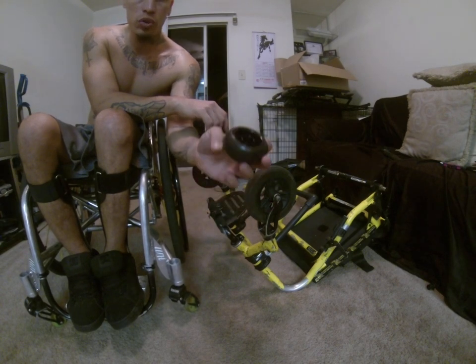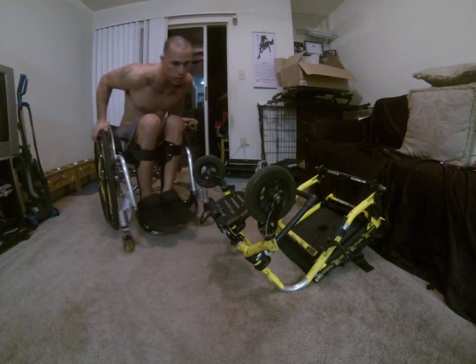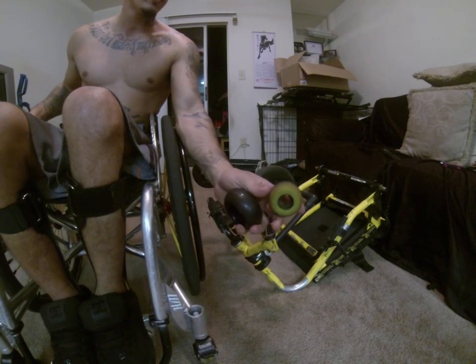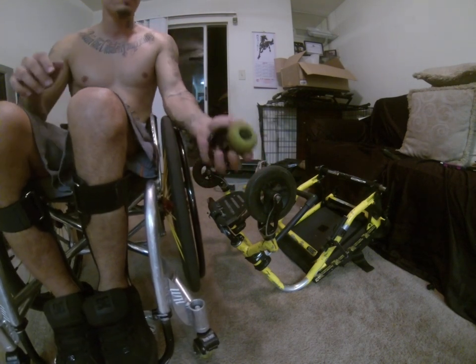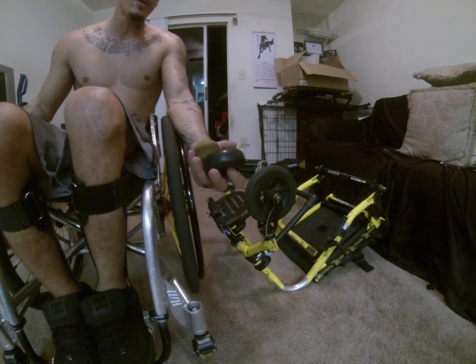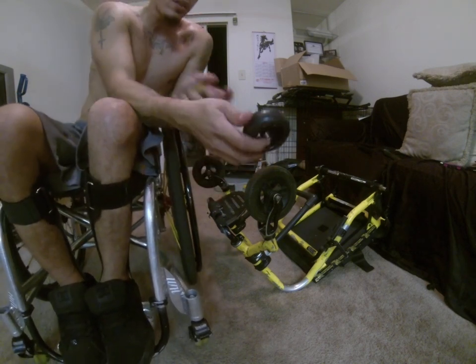It can either be a scooter wheel or a wheel like this. This one came with my box wheelchair, the one I'm riding on right now, or you could change it to an even smaller wheel, like the skateboard wheel I got on here. This is an OJ Little Duty 58mm. But if you're not going to be out in the skate park or something like that, you don't really need to put one of these on there. I just put them on there because rotation spin is a lot better, and I don't get caster flutter when I'm flying down the skate park. So today I'm going to show you how to change into this one.